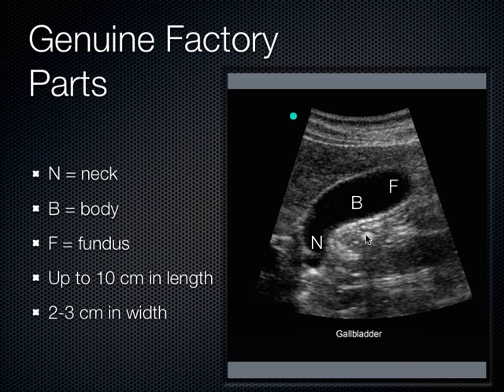Yes. Okay, now knowing that, think about how sound comes out of the probe. You think about sound being microscopically thin, but actually the sound that comes out of the probe has some thickness. In this example, the thickness of my fingers is maybe 1 centimeter thick. Sound is about 1.5 millimeters thick.